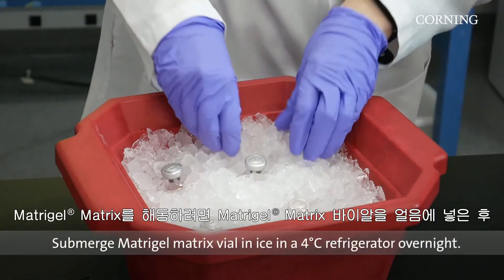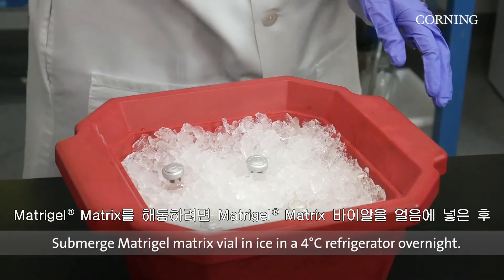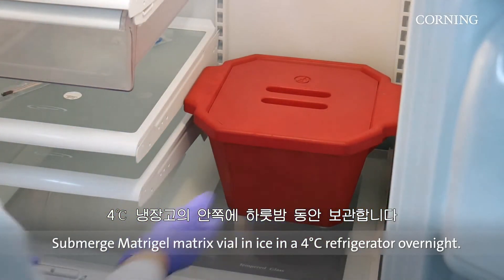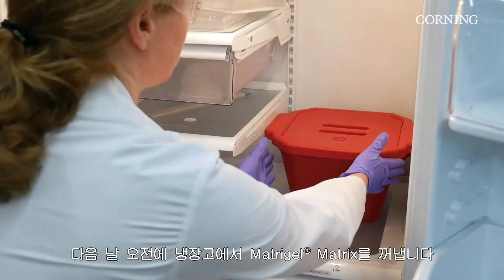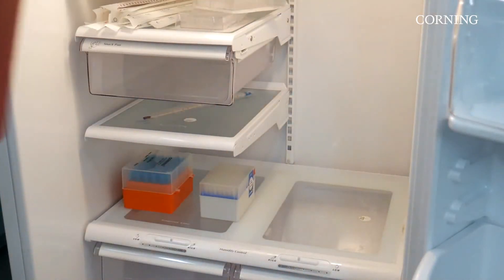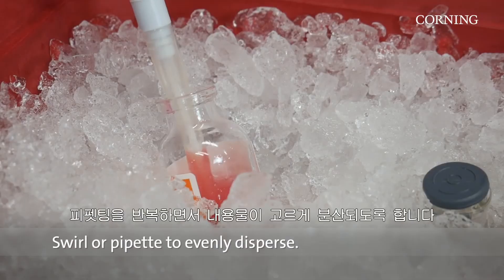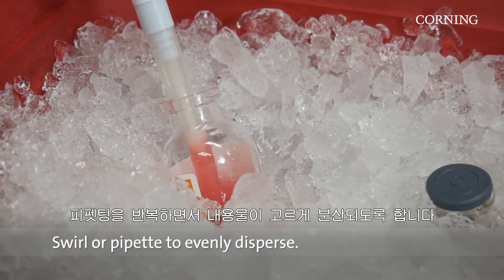To thaw your Matrigel Matrix, submerge the vials of Matrigel Matrix in ice in a 4 degrees Celsius refrigerator in the back overnight. Remove the Matrigel Matrix from the refrigerator in the morning. Once Matrigel Matrix is thawed, swirl the vial or pipette up and down to ensure that the material is evenly dispersed.